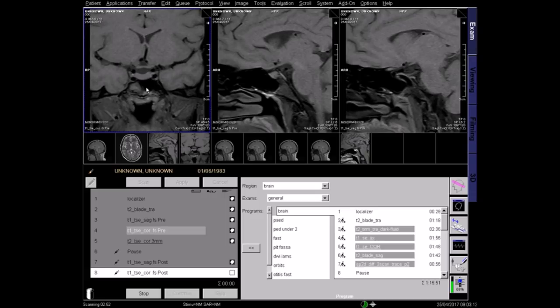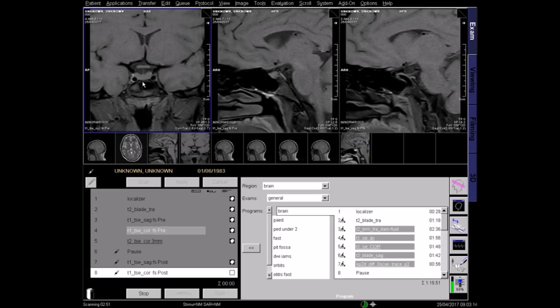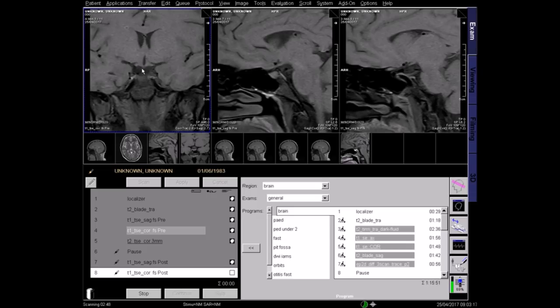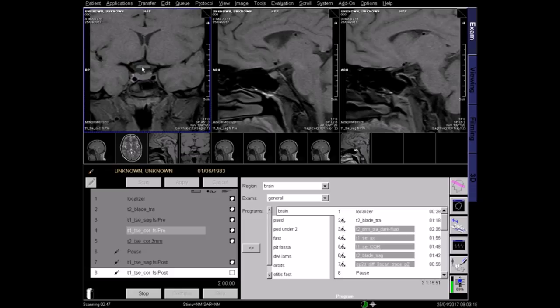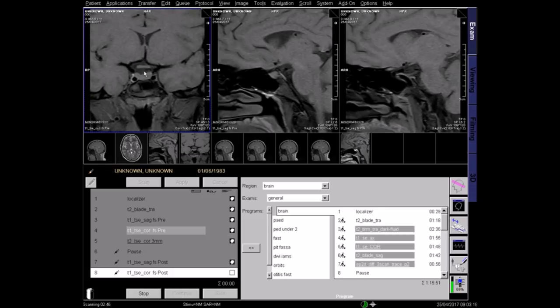This is a T1 coronal fat-saturated image. Here is the pituitary gland with the internal carotid arteries on either side. Check that the gland is covered anteriorly and posteriorly.